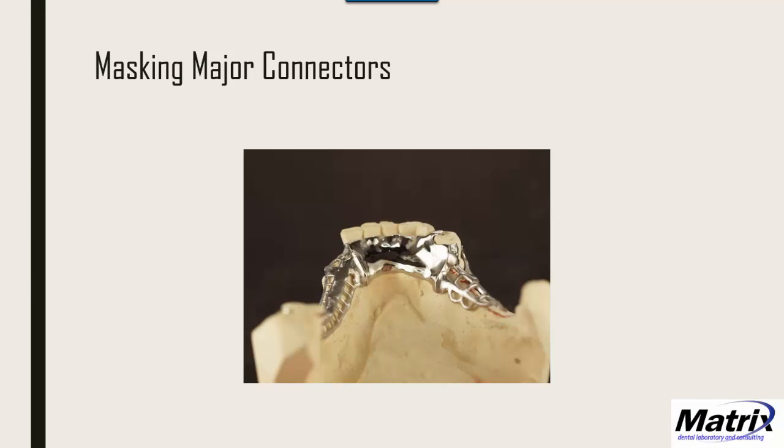I mostly started by masking major connectors — those that don't flex — looking at lingual aprons and palatal straps. The cool thing is many of these partials are already in the field, and when they come in for servicing — a reline or tooth repair — this is an ideal service to offer the doctor and patient as an upgrade to their existing partial denture.